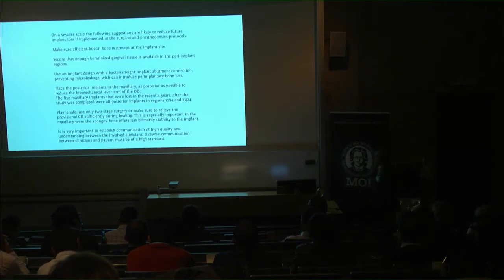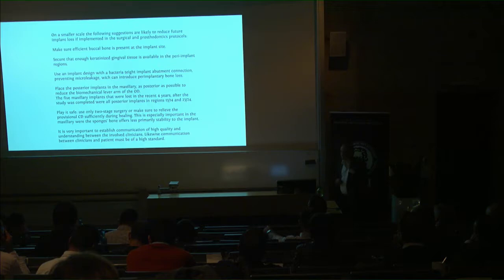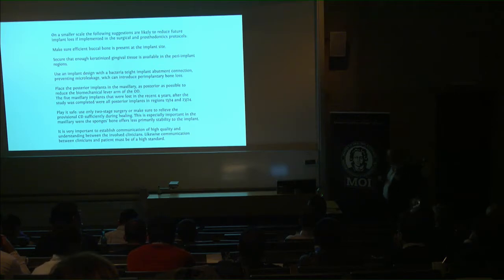Clinical implications. Make sure there's sufficient bone. Buccal bone must be represented at the implant site. Secure that enough keratinized gingival tissue is available in the peri-implant region. Use an implant design with a bacteria-tight implant-abutment connection, preventing microleakage, which can introduce peri-implant bone loss. And this goes for every implant you place, really. Place the posterior implants in the maxilla as posterior as possible to reduce the mechanical lever arm on the overdenture.